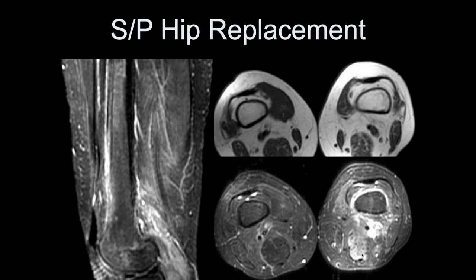And then we can see a little edema here. This was just an overuse injury because the patient started walking more after they got their hip replacement.